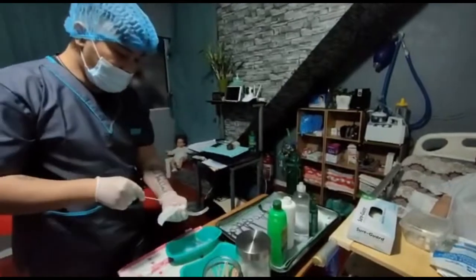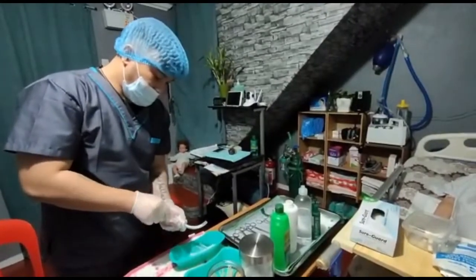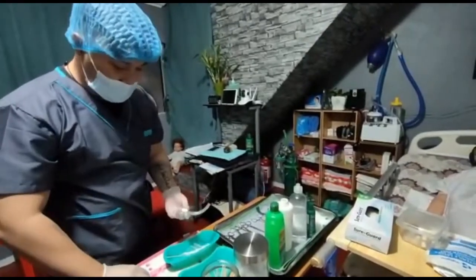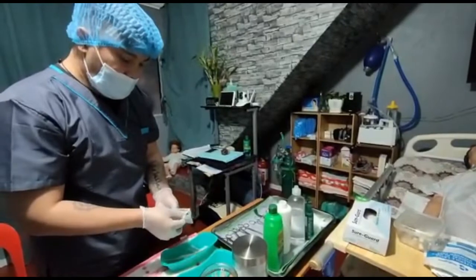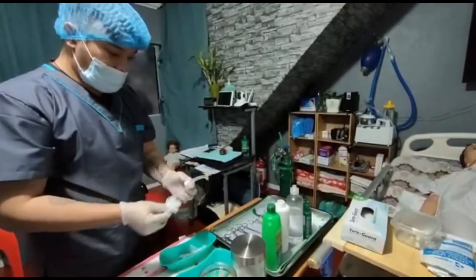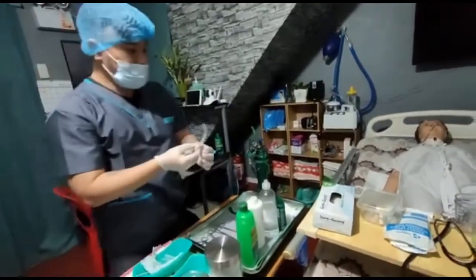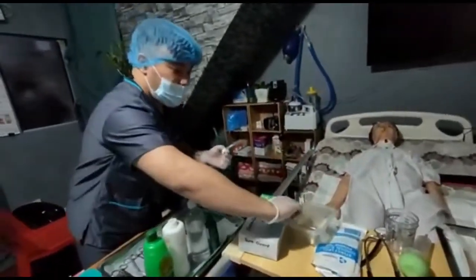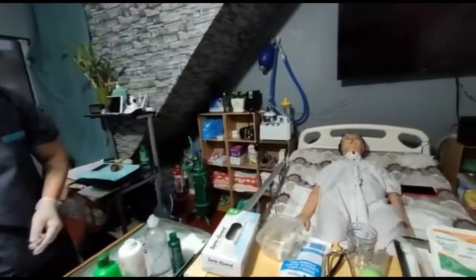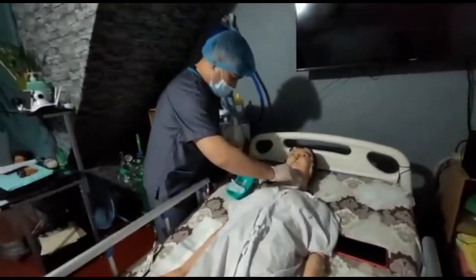Dito din po, kailangan natin linisin yung loob niya. And mag-dry. And since outer, single stroke lang po gagawin natin dito. So bawat, good end niya. So this is okay. So ngayon po is ating ilalagay po siya sa sterile na tray. And then atin na pong tatanggalin yung temporary cannula.